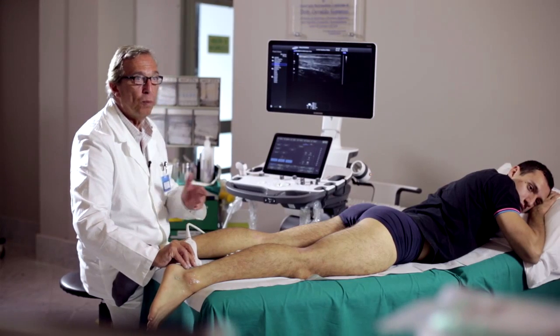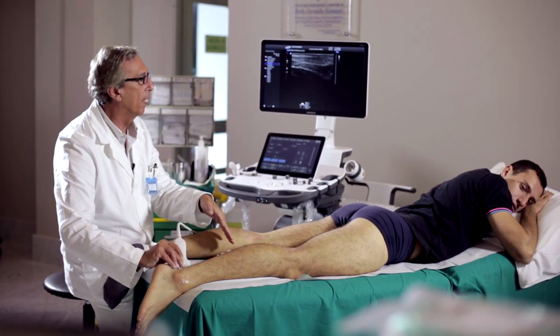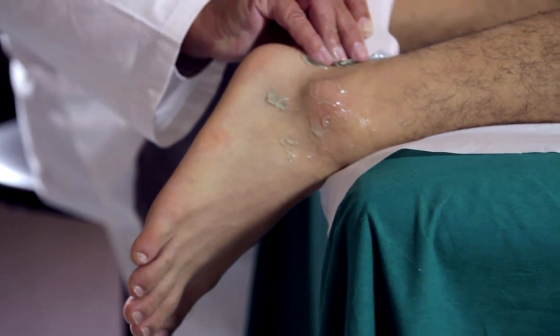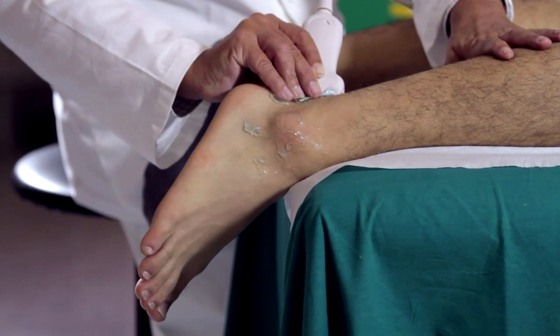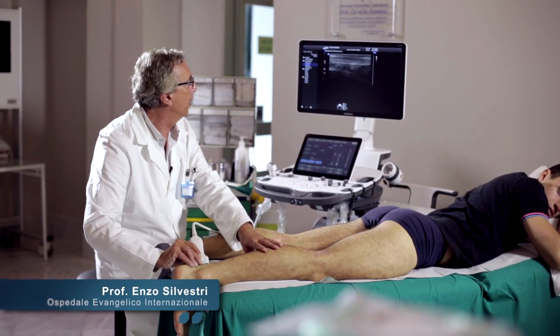We do the scan with the foot outside of the bed and we ask the patient to flex the ankle on both axes to perform a dynamic study. This way, you can examine the tendon during its own natural activity.